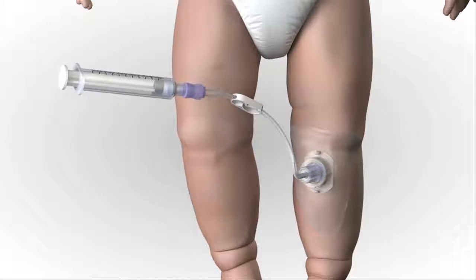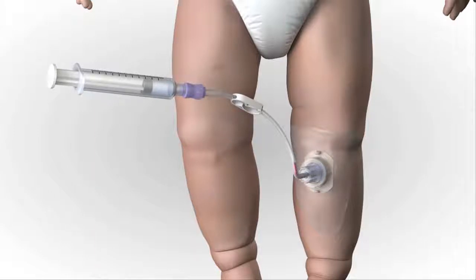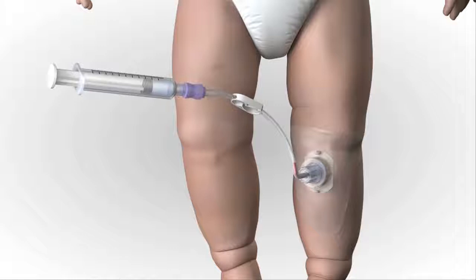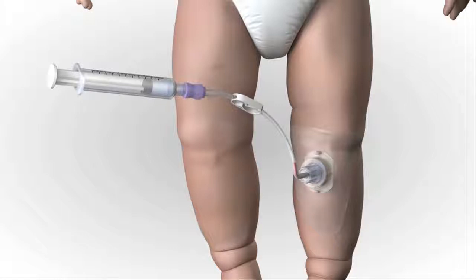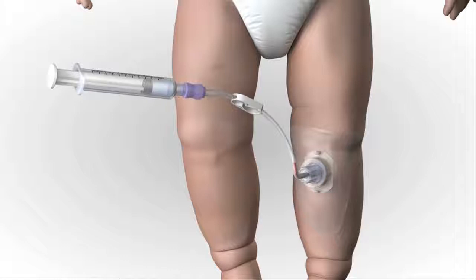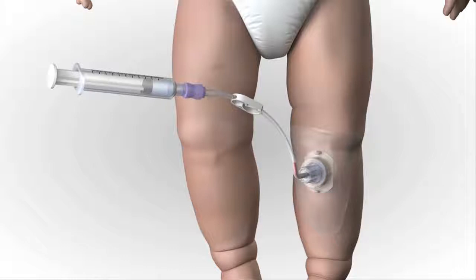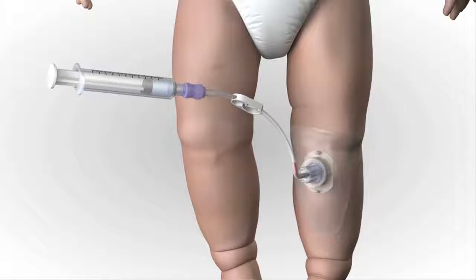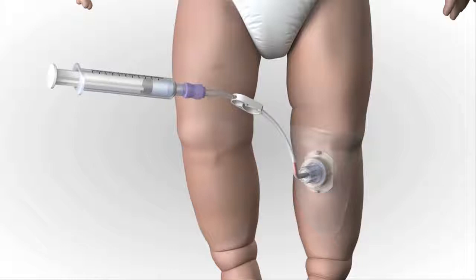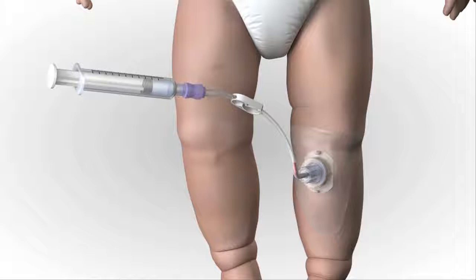Aspirate for blood and bone marrow. Inability to withdraw aspirate blood from the catheter hub does not mean the insertion was unsuccessful — consider attempting to aspirate after the flush. Site placement can also be confirmed by the ability to administer pressurized fluids and noting the pharmacologic effects of medication administration after flow is established.